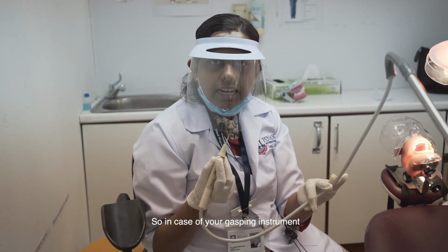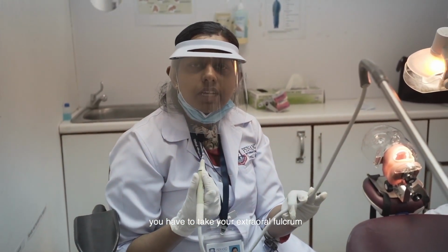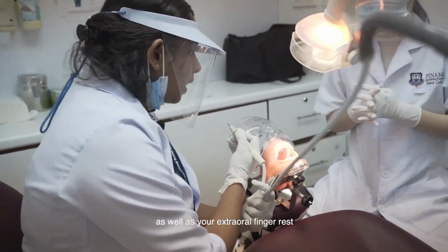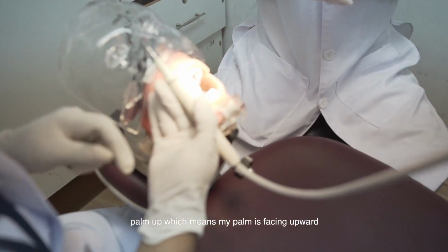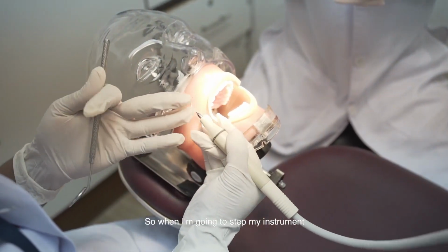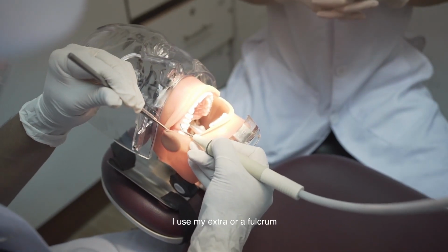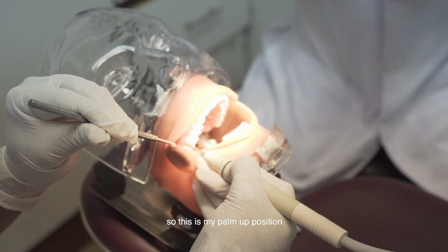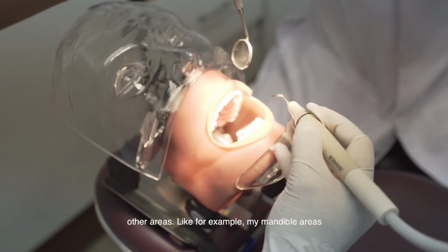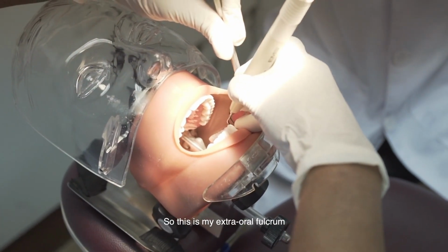So for grasping your instrument, you use your modified pen grasp, and when placing the instrument in the patient's mouth, you have to take your extraoral fulcrum as well as your intraoral finger rest. You do have 2 fulcrums. One is your palm up, which means my palm is facing upward. When I am going to step my instrument on my maxillary molars, I use my extraoral fulcrum, whereby my palm is faced up. This is my palm up position. And when coming on to other areas, for example my mandible areas, I use my palm down position. So this is my extraoral fulcrum.